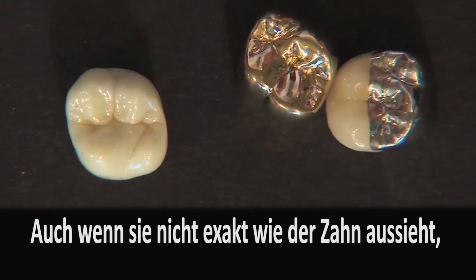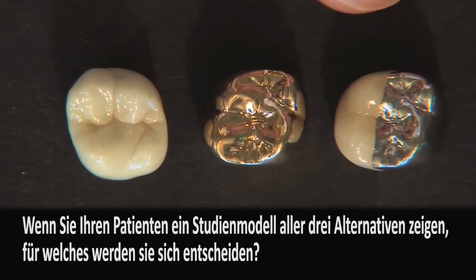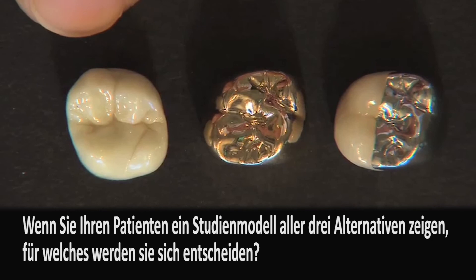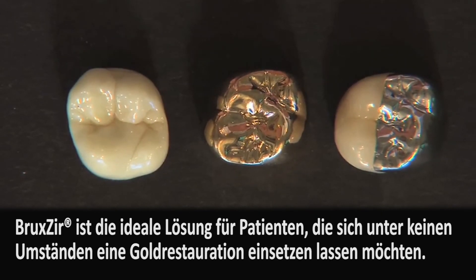Now, if you look at it, it doesn't necessarily look exactly like a tooth — and I'll show you some pictures of BruxZir crowns in the mouth in just a second. But that's not the point. This crown was not designed to be an aesthetic crown; it was designed to be more aesthetic than cast gold and more aesthetic than a metal occlusal. If you had a study model with all three crowns and told your patient they could choose, what are the chances they're going to take this crown — even if it doesn't match the first molar in front of it perfectly? Really, BruxZir's primary indication in my mind is when you want to place cast gold and the patient simply won't accept it — BruxZir is a fantastic restoration in cases like that.